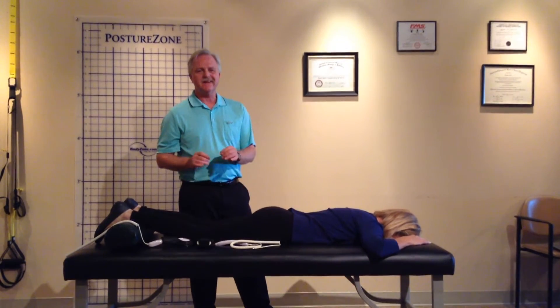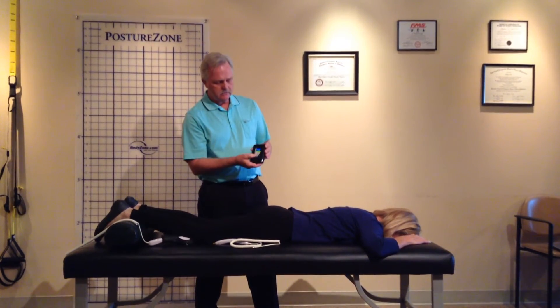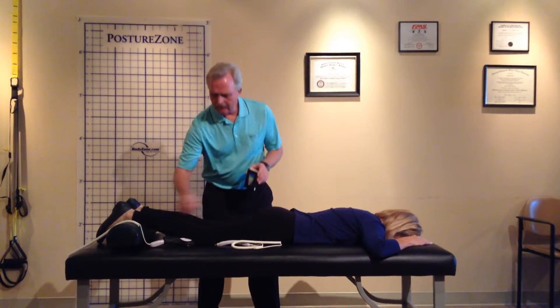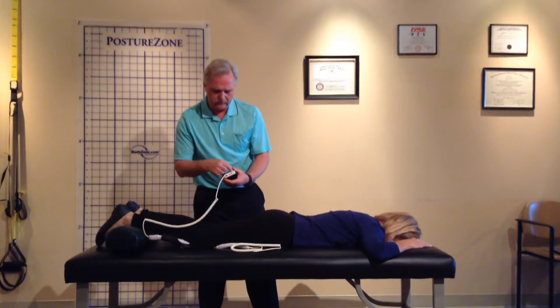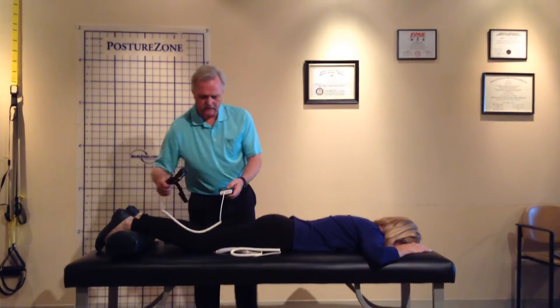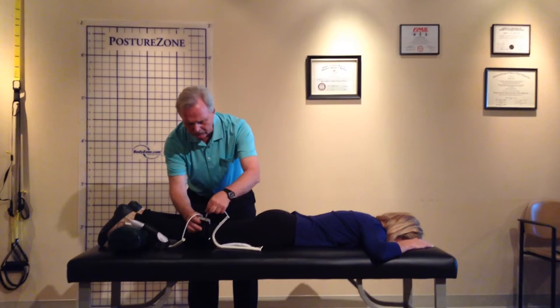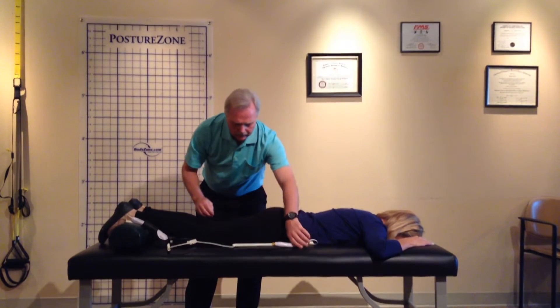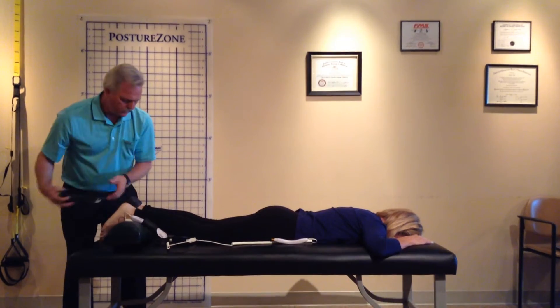The new laser I'm really excited about, and it's totally hands-free. You simply push the button on the module, set the number of cycles up to almost 10 minutes for one whole round. And you plug in to one of the two ports available, because we can now have two heads to use for enhanced treatment. While we're treating one area, you can plug the second head in at the same time.